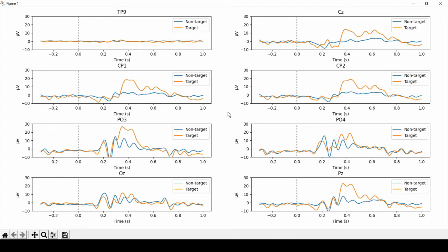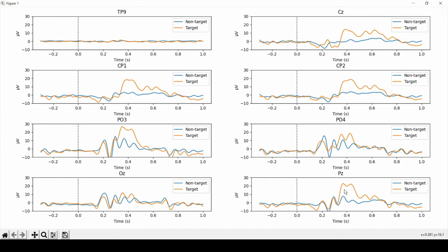Going to PZ, we have this positive peak whose onset is around 300 milliseconds, and goes over here in a positive peak that is only visible for the targets compared to the non-targets.